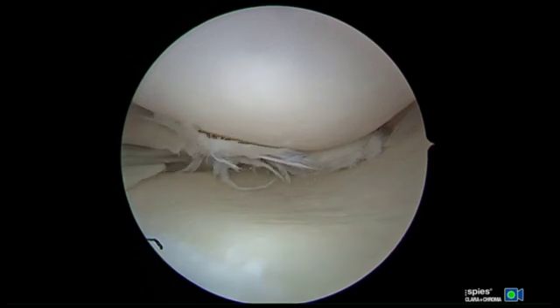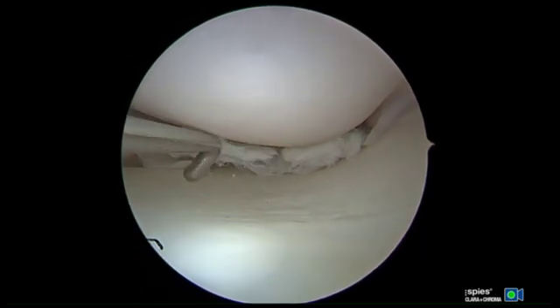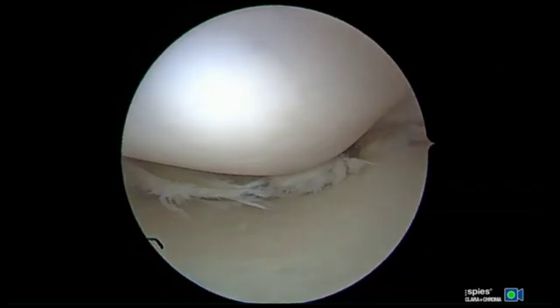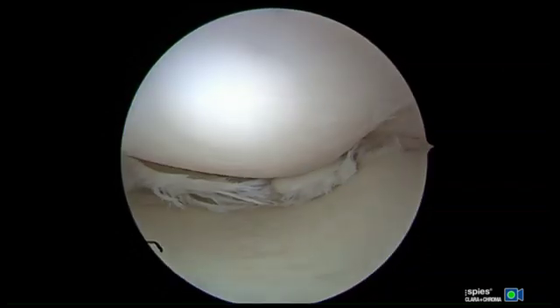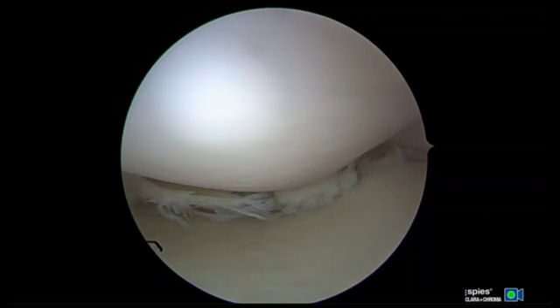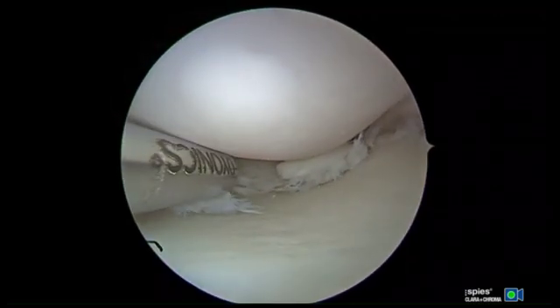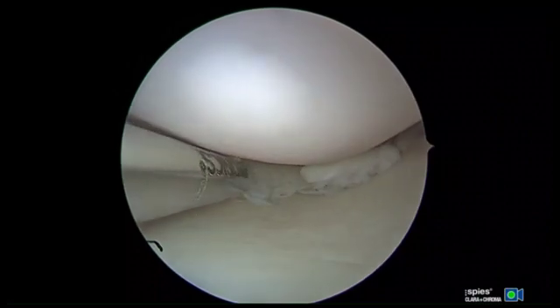This video focuses on the medial compartment after completion of the diagnostic arthroscopy. It is important to place your portal such that you have a direct approach to the meniscal injury. Portals placed too superiorly or inferiorly may compromise adequate access to the meniscus. The tear is initially identified with the probe to inspect the full extent of the tear and to confirm the tear type.